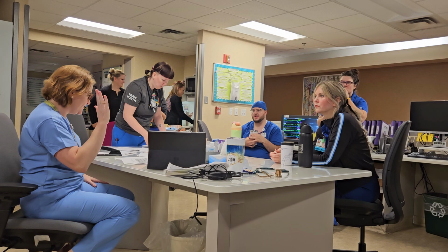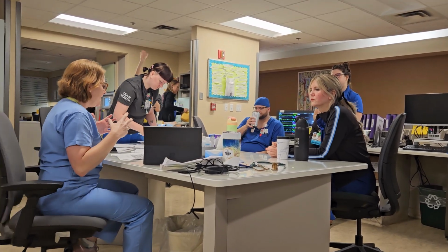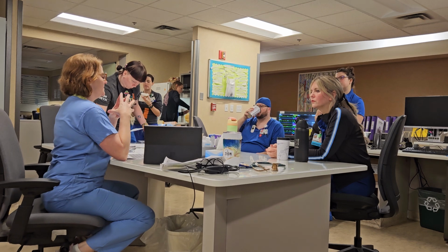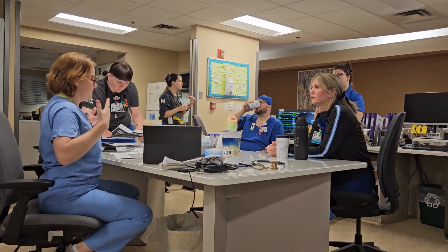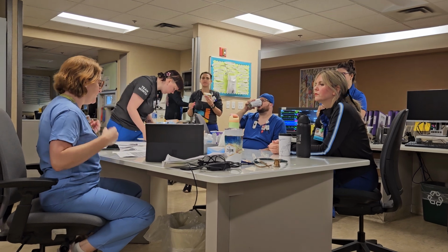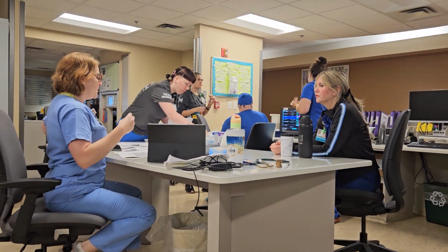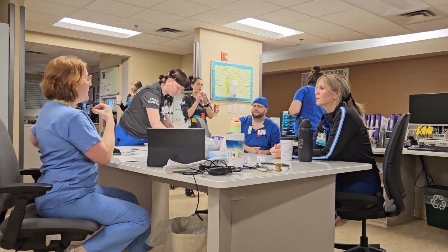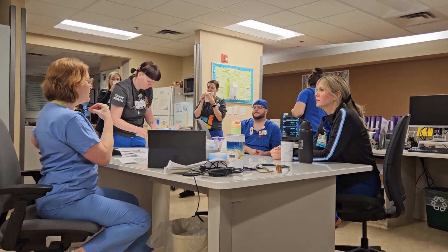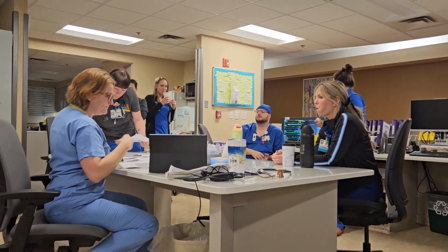Ventilation involves a patient, an ET tube, and a ventilator. We provide ventilation to patients via positive pressure ventilation. We normally ventilate using negative pressure when we're not on a ventilator because we suck in to take in a deep breath. But when we place somebody on a ventilator and we inflate that cuff, we inherently take away that person's own PEEP, and we are ventilating them by pushing air in.